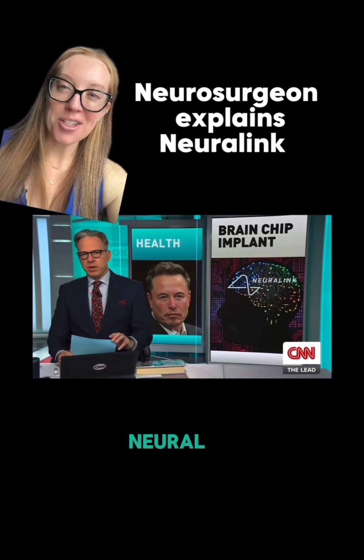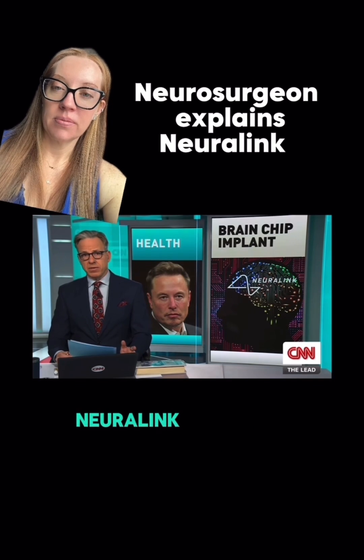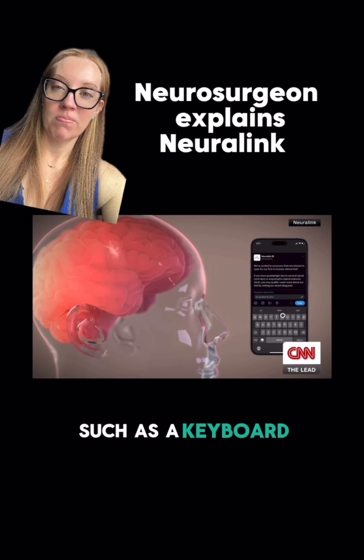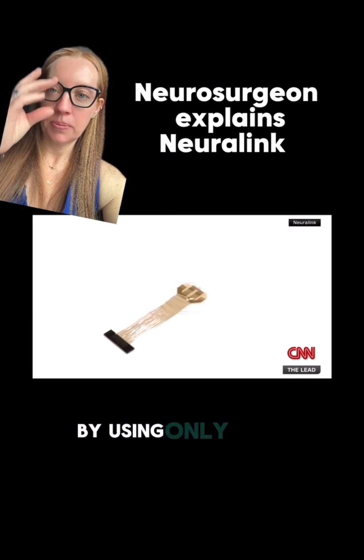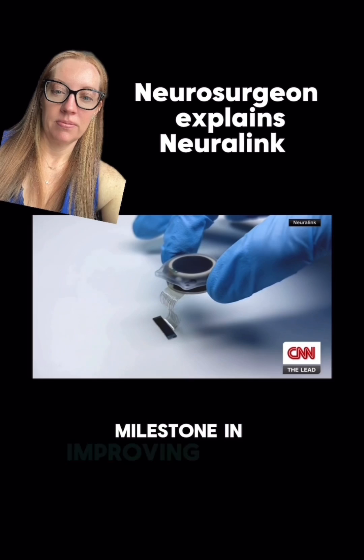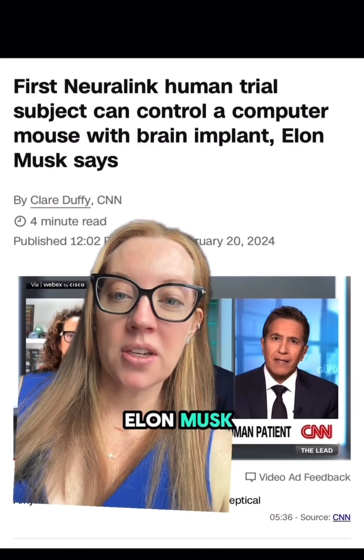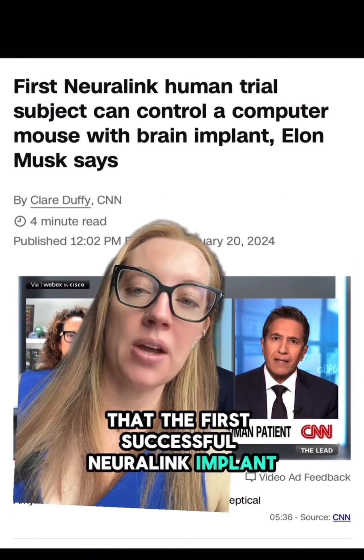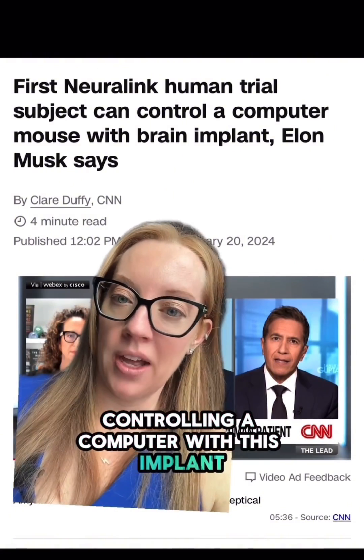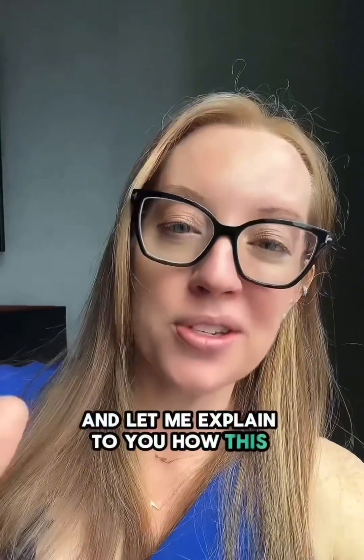Watch this video — I'll explain in a minute. Elon Musk announced last month that the first successful Neuralink implant was placed into a human, and now that patient has been reportedly controlling a computer with this implant. My name is Dr. Betsy Grunsch and I am a board-certified neurosurgeon, and let me explain to you how this device may work.